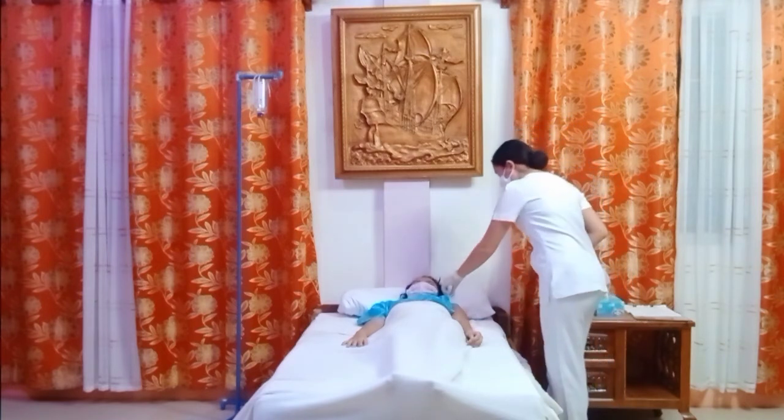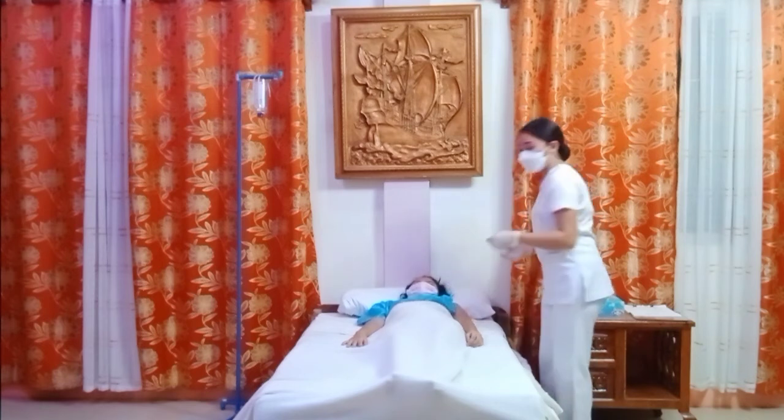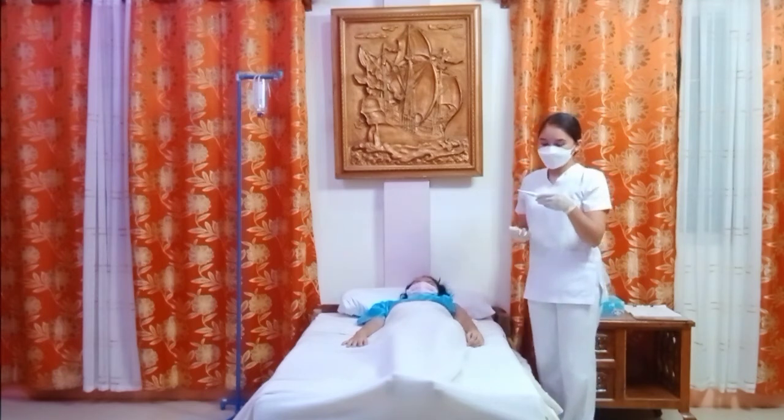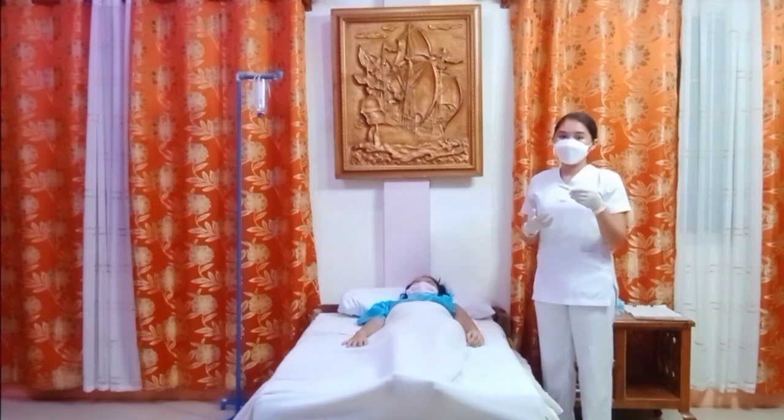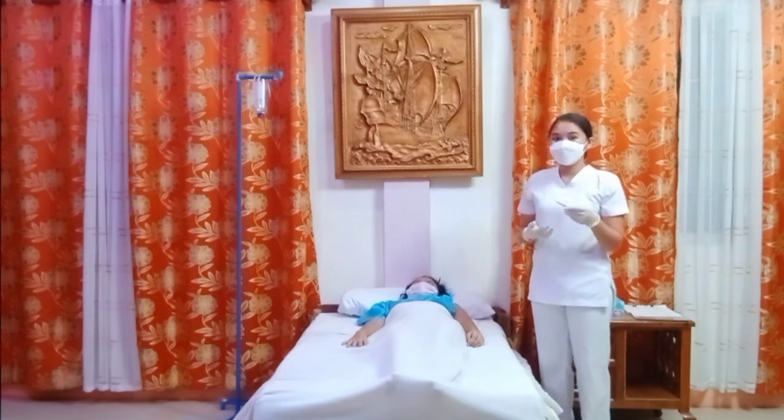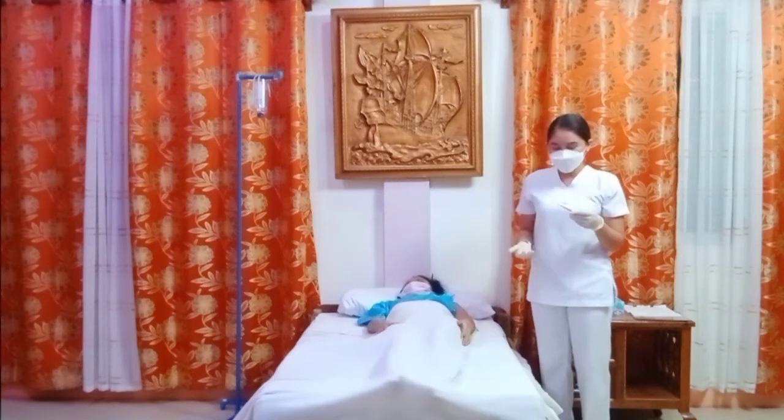Next is to remove the thermometer for the nurse to assess the results. Next is to disinfect the thermometer to prevent cross-contamination and the spread of nosocomial infections.